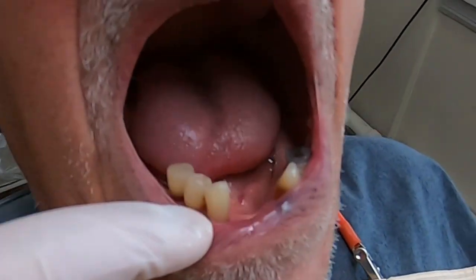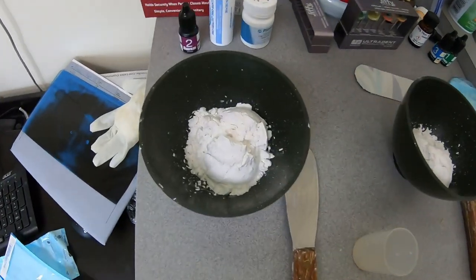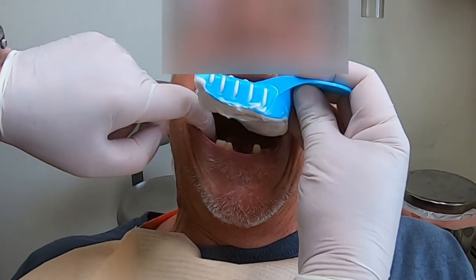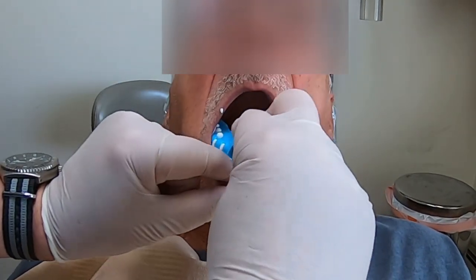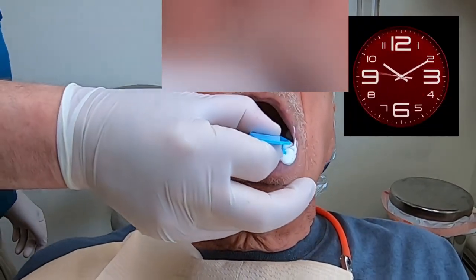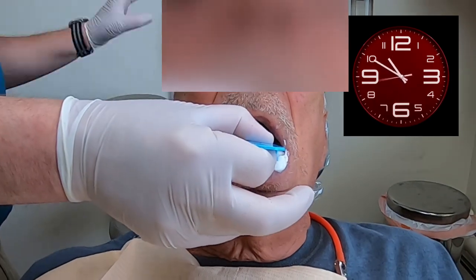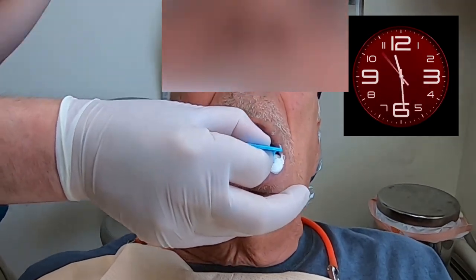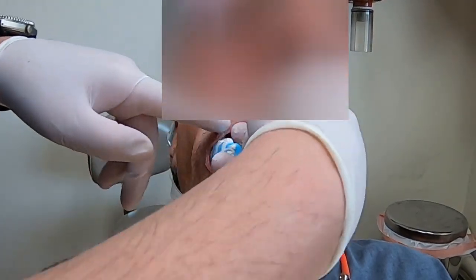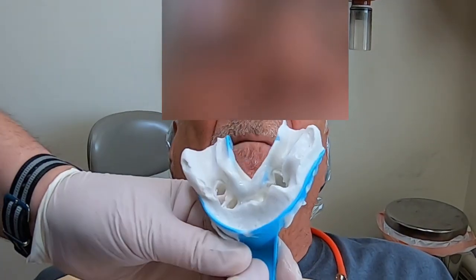Here's a quick look at the alginate impression material — the powder and the bowls. So we mix it up, put it in the stock tray, and take the mold. I'm going to take a lower mold first, just because it's easier for the patient. With a lower impression, you're less likely to gag. The material sets up fast, but not fast enough to show it in real time, so I sped it up a bit for you. There — we got the lower mold.